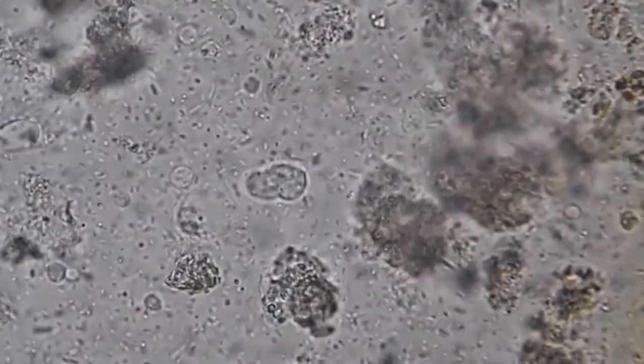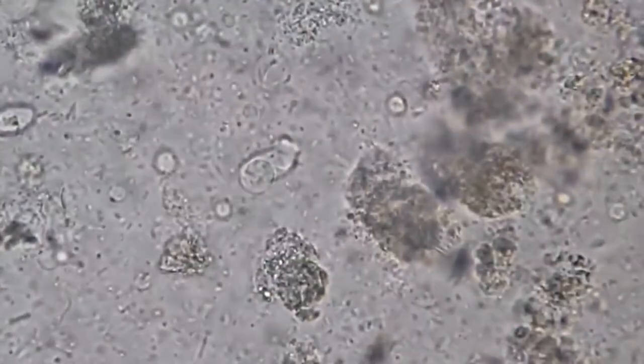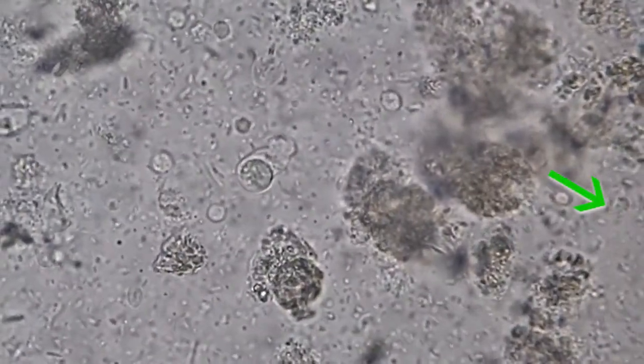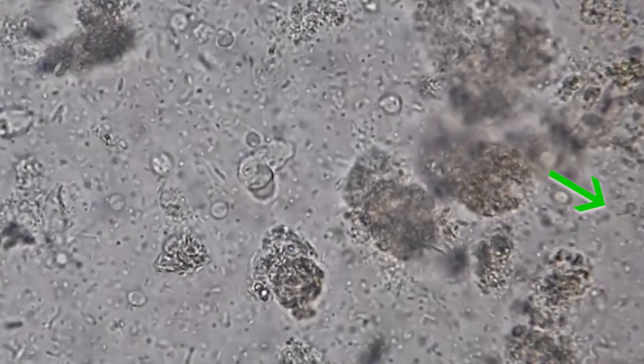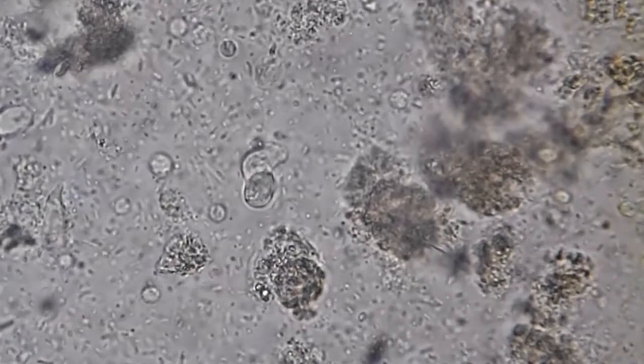I want to point out there are some other things moving in the background there, such as here. This movement you're seeing here in the background, that is Pentatrichomonas hominis. So this person has two parasites. They have both Entamoeba histolytica, which is a pathogen. They also have Pentatrichomonas hominis, which is a commensal.